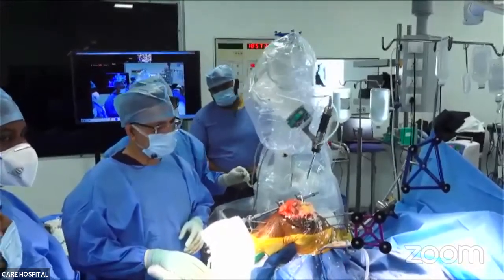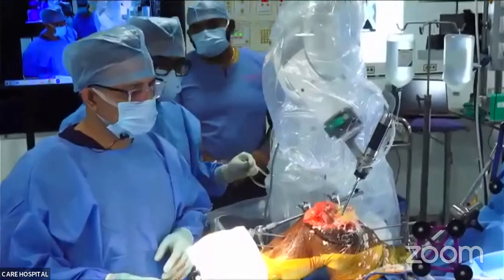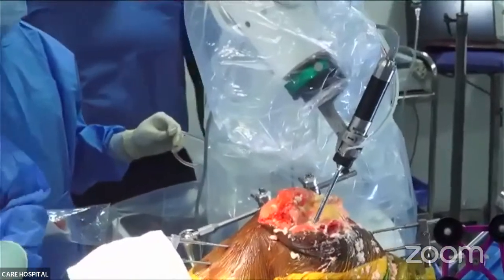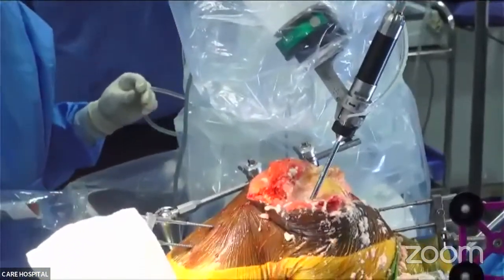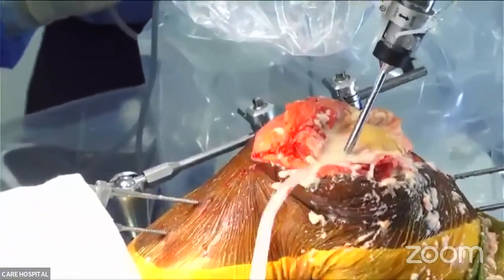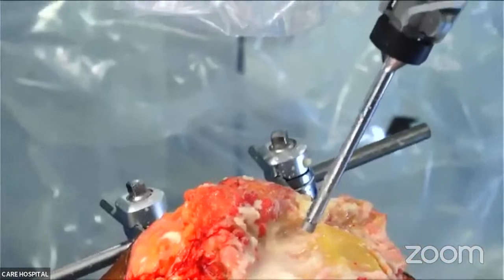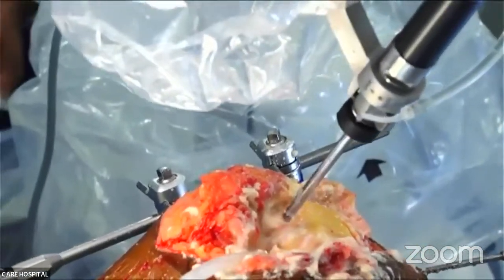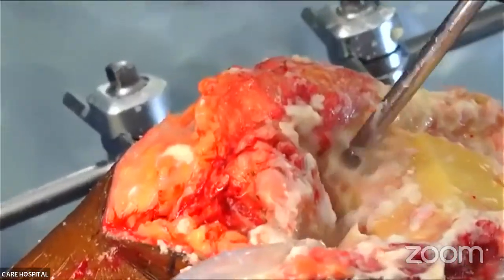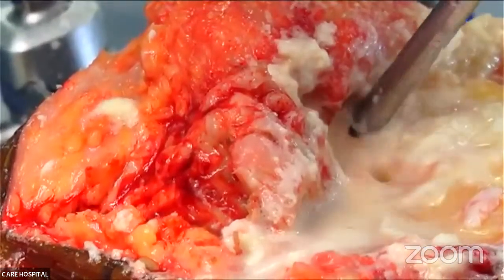So it has got a so-called 6-dimensional flexibility. The robotic arm is reorienting itself. So the posterior chamfer cut, and after that we'll do the box cut.